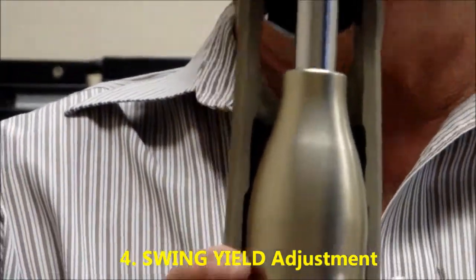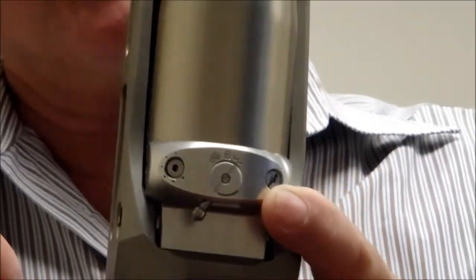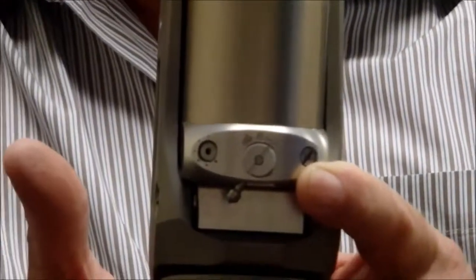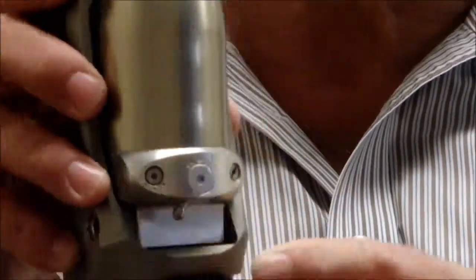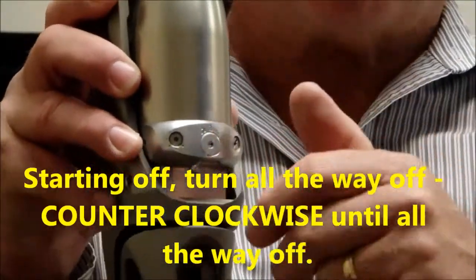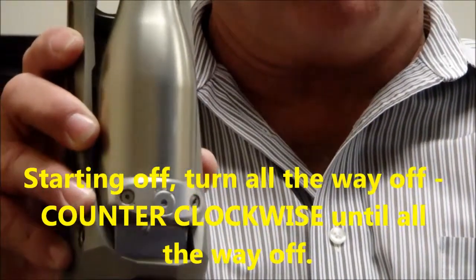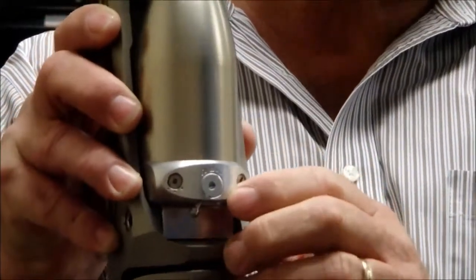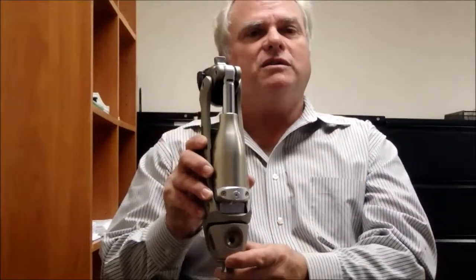Swing yield is all about the length. A long leg is going to have more fulcrum action and needs more resistance in the knee. A prosthesis where the foot is mounted at the bottom of this knee needs extremely low resistance. I recommend for everybody to start off with this yield turned all the way off, or counterclockwise until it comes to a stop — there is a stop, don't try to overpower it. So bring it to the stop, bring this lever all the way over, and that's where you really want to start, then slow down the heel.